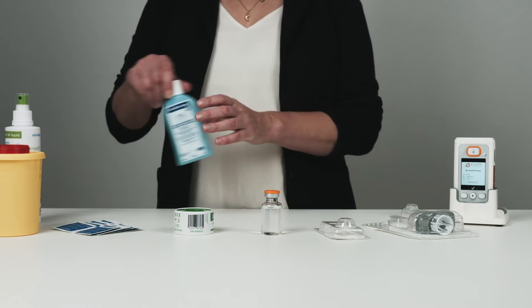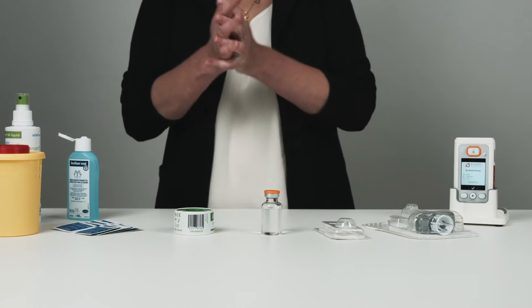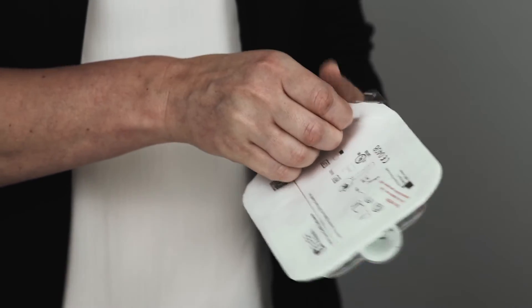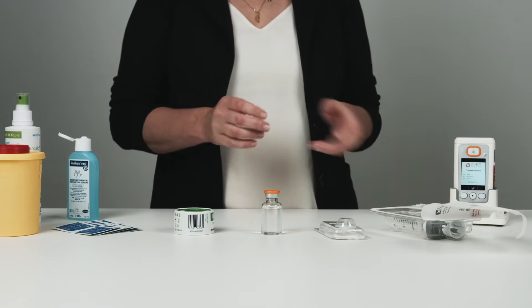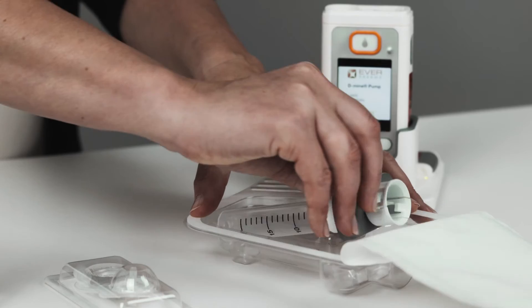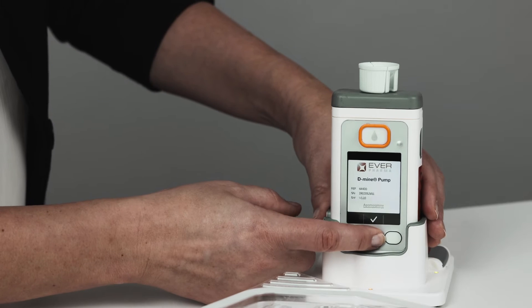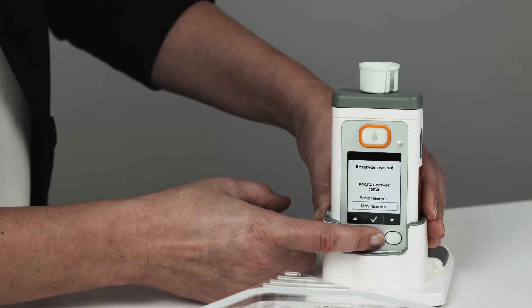Disinfect your hands and open the packaging of the sterile D-MIME reservoir. Insert the reservoir into the pump — you will hear a click when it is correctly positioned. The pump will ask if a new reservoir has been added; confirm this step by pressing the checkmark button.